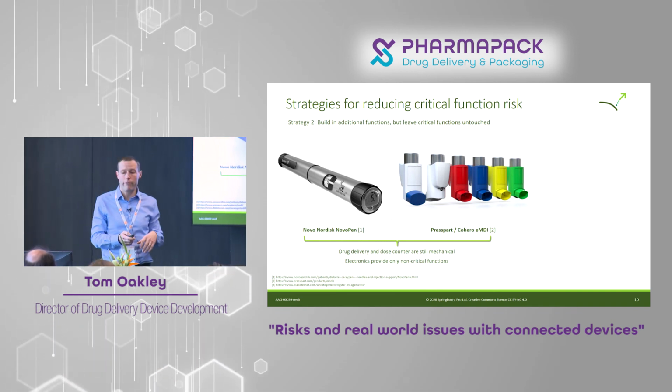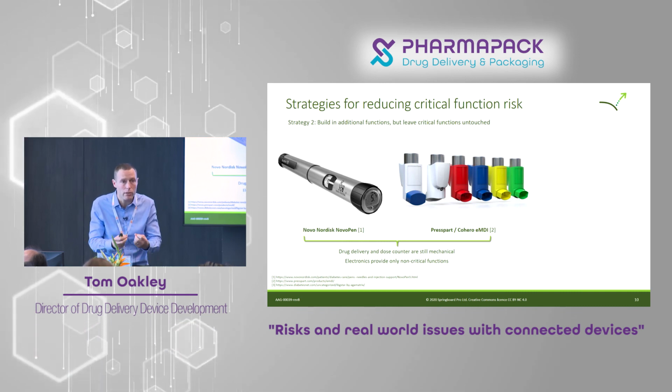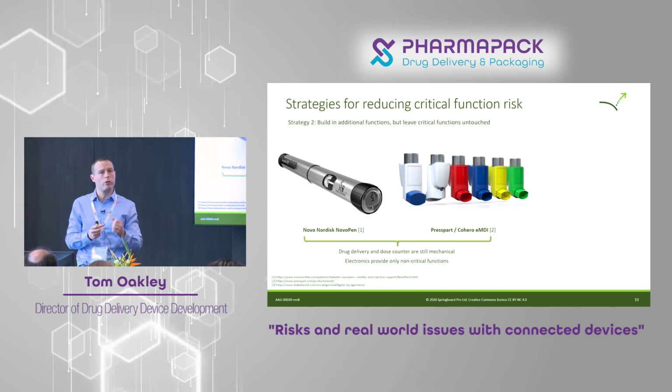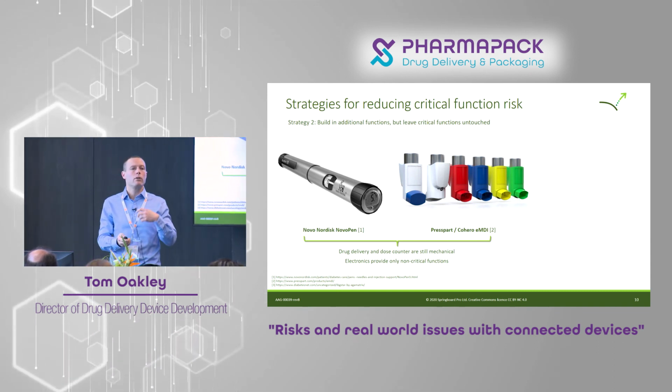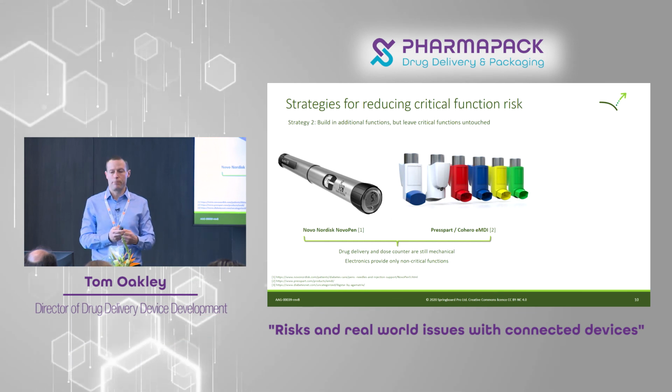And in the middle, we have inhalers here, where the dose delivery and the dose counter are still the proven mechanical system. They've added this backpack, this bulge on the back, which has the connectivity, which gives you the added benefit, but they have not added risk.